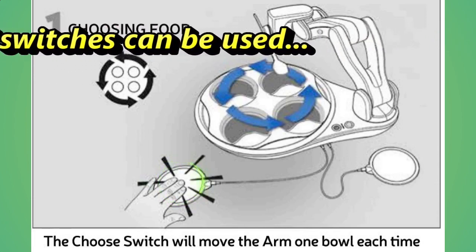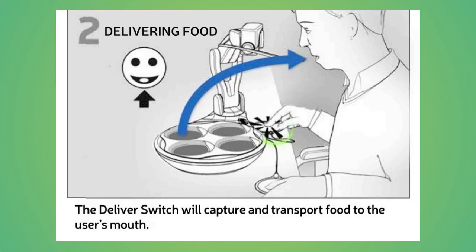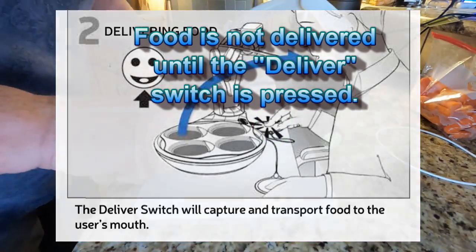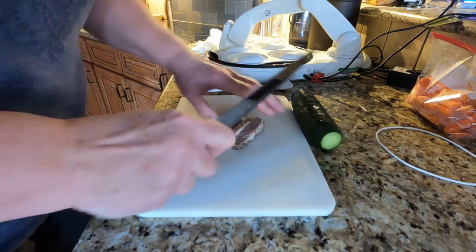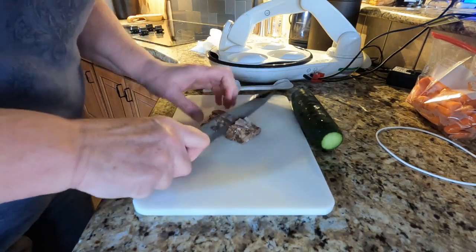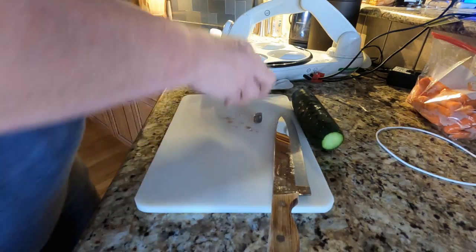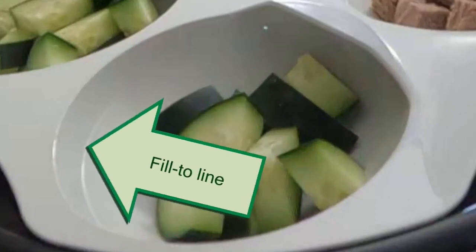Each time the select button is pressed, OB's spoon will move in a counter-clockwise direction until it's over the food you want to eat next. The second switch is the delivery button that tells OB it's time to take a spoonful of food to the delivery location set for your eating session. Food should be cut up into bite-sized pieces, no larger than three quarters of an inch to fit better on the spoon. Smaller morsel sizes are also recommended for anyone experiencing swallowing problems. Food bowls contain a recommended fill-to line that indicates a four-ounce portion.